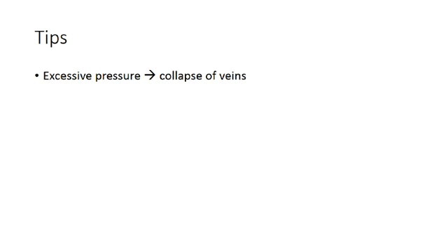And so, just like with the femoral, with the saphenous vein in the groin, the popliteal vein, the weight of the leg is actually hitting against the probe, because you're scanning from behind. And if a patient is lying in bed like the ICU patients, then the gravitational weight of the leg is actually pressing down against the probe, and this is often enough to compress the popliteal vein. And you'll be searching for the vein and you won't find it, and that's because you're actually doing a compressibility test already.